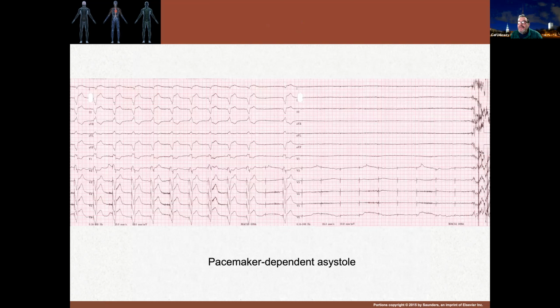And this slide is another interesting case. In this individual, and you can see this particularly in the V leads, see these spikes here. These are pacemaker spikes, particularly they're ventricular pacemaker spikes. And what you see is that in order to generate the ventricular QRS complexes, we need to administer this shock to the ventricles at that point.